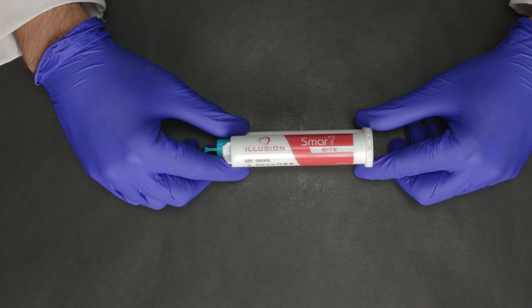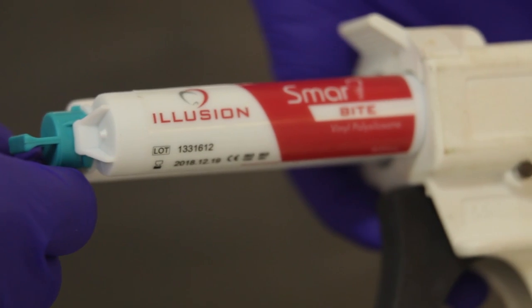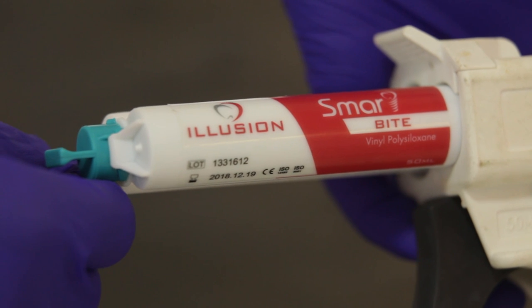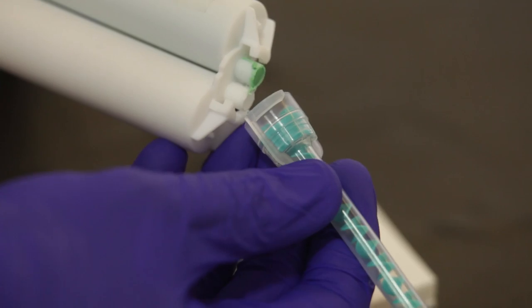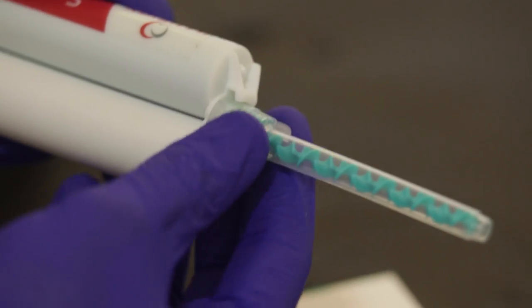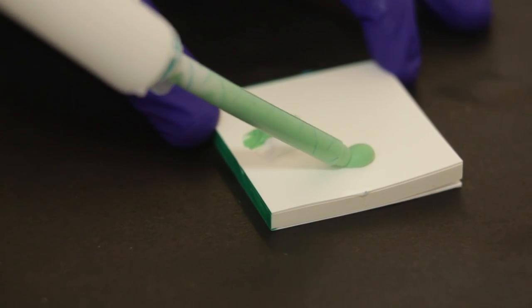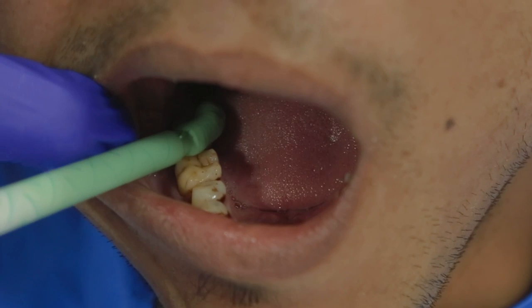The ideal way of taking a bite is using a VPS bite material, which comes in the form of a cartridge. This is the Smart Bite, which is a VPS bite material from Illusion. The first thing you need to do is bleed out the cartridge and attach the mixing tip. The best part about Smart Bite is that it is very rigid, so obviously there is no distortion. We extrude some more material to ensure uniform mixing, and then take it over to the mouth and ask the patient to bite on it.